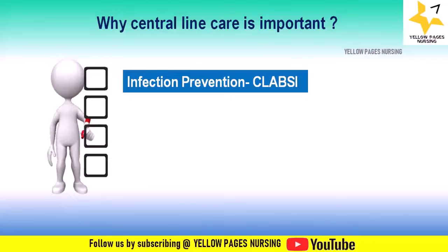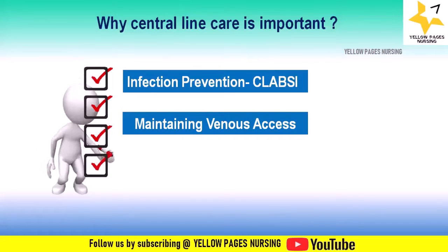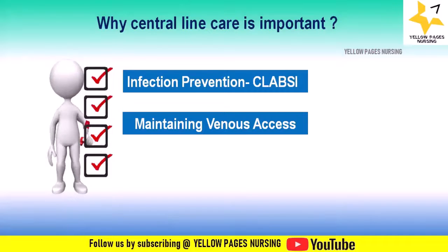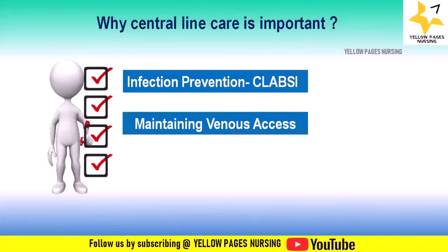Then, maintaining venous access. Central lines are essential for various medical interventions including the administration of medications, parenteral nutrition, hemodialysis, and frequent blood sampling. Adequate care ensures the longevity and functionality of the central line, reducing the need for repeated insertions and preserving venous access.